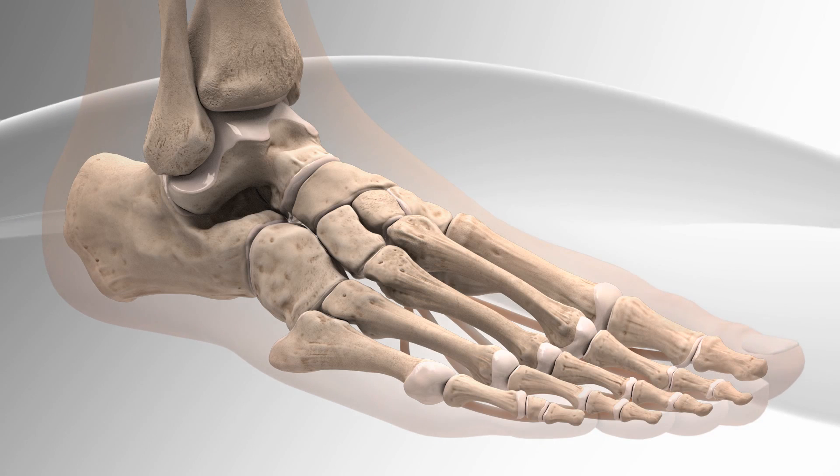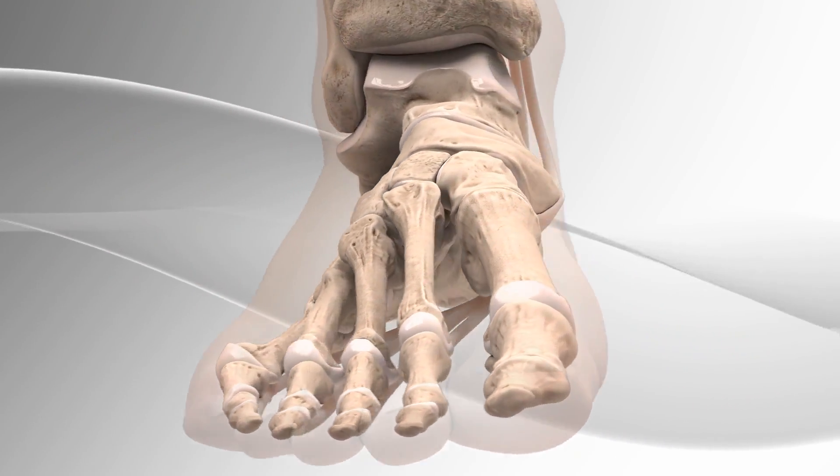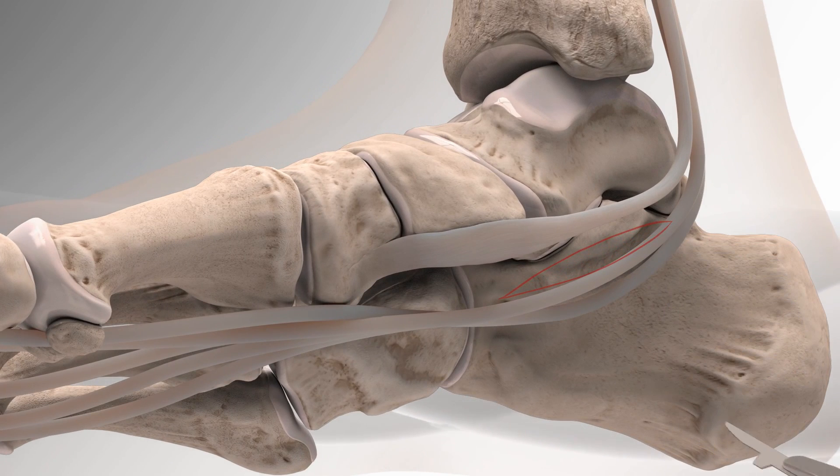Flat foot is when the arch of the foot collapses, coming into contact with the ground. The repair begins with the surgeon making a cut on the side of the ankle where the calcaneus, navicular bone, and medial cuneiform are located.